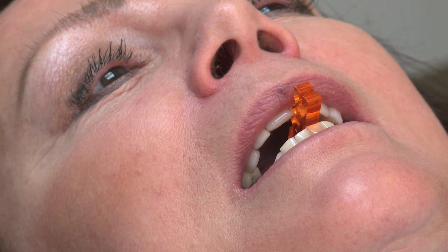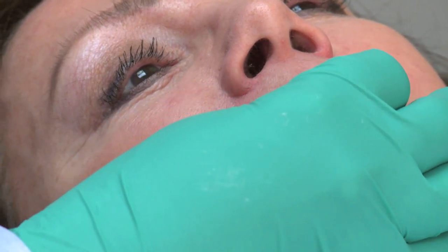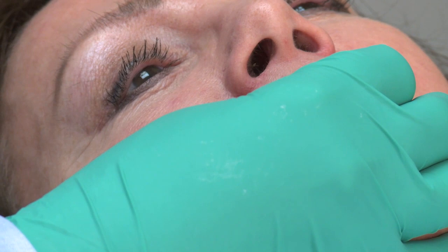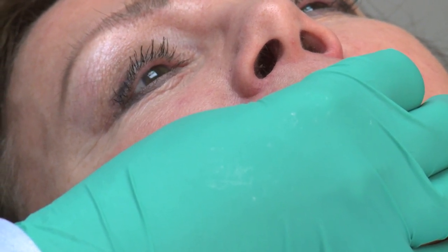Close. For video purposes, I'm going to remove my hand so you can see the key in place. This is 6 millimeters of vertical edge to edge. I'm going to go back and hold the key. Go ahead and give us your best snore, Kim. We're still hearing some little bit. Nasally constricted airflow.